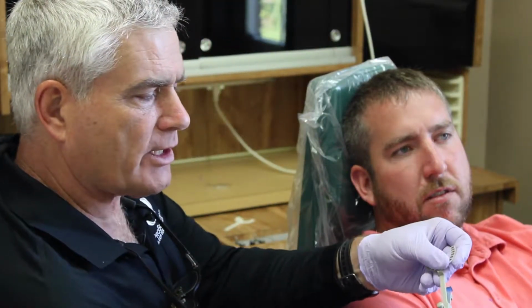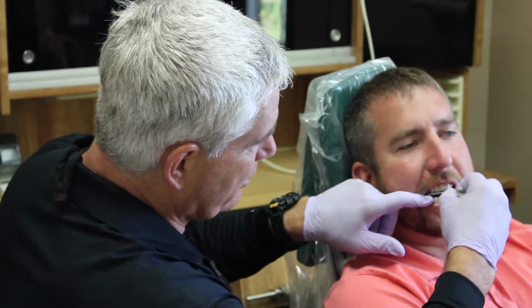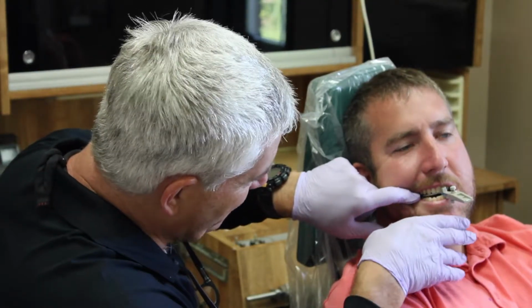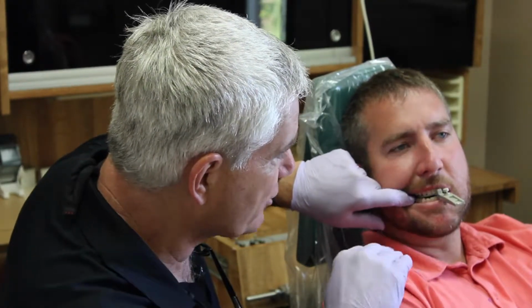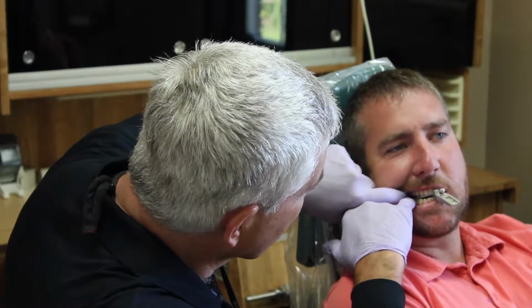So I'm going to take first the gray one, and put it in here, slide it right into this top notch, and then I'm going to have him just close down over both of those. And then I'm going to look back here and make sure that I've got, you just go in your normal bite, thank you. I'm just going to look back here and see if he's got enough clearance, because I need 3 millimeters between his upper and lower incisal edges. And you've got to watch for cusp tips hanging down or excessive curve of Spee. If I look back there, it's pretty close. It's close enough that I'm pretty sure on that second molar I don't have clearance.